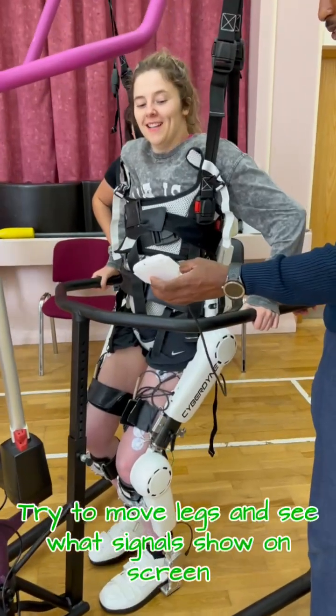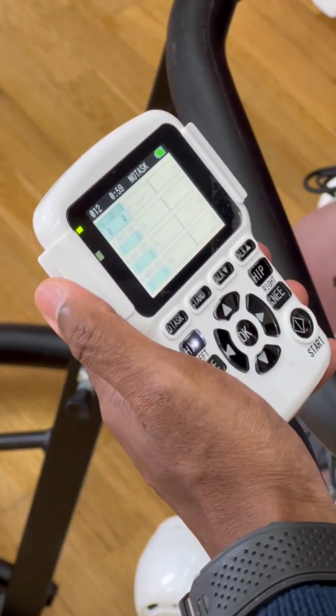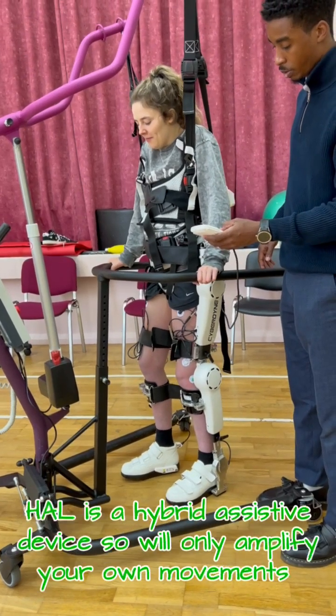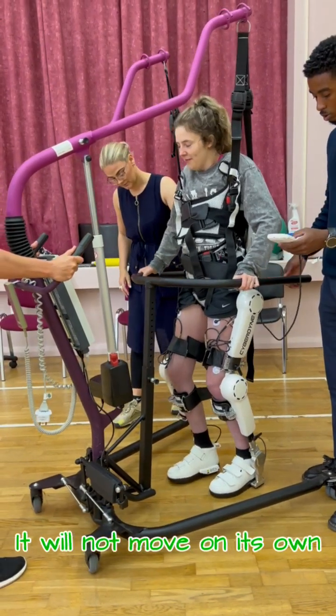Try to move your legs and see what signals show on the screen. The device will only move if it picks up signals. HAL is a hybrid assistive device, so it will only amplify your own movements — it will not move on its own.